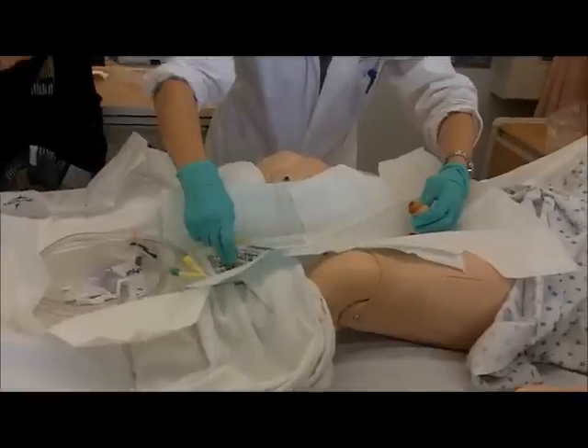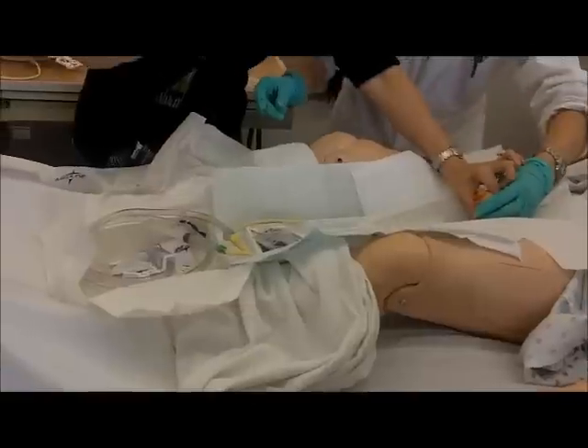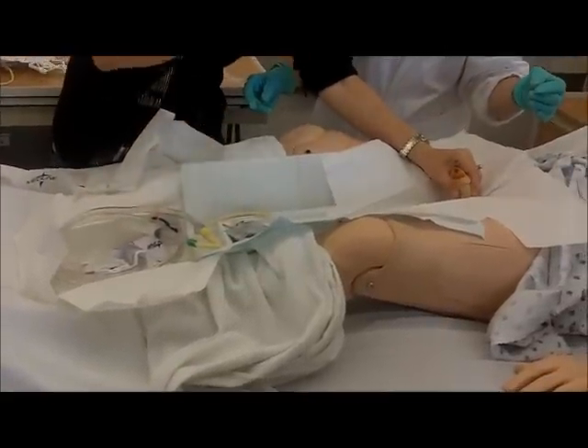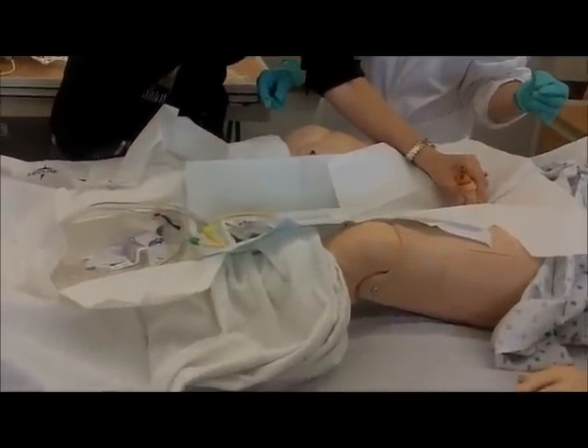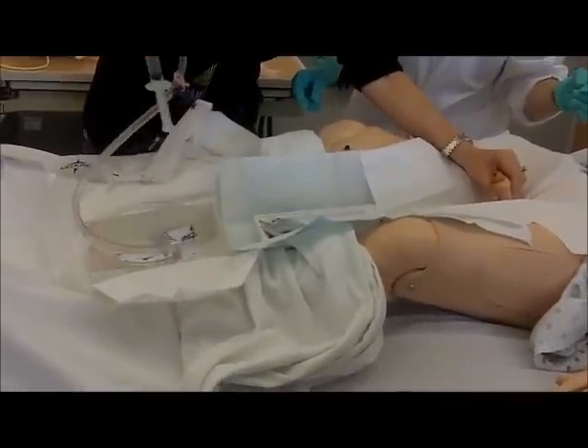You don't need to do it a third time, that's okay. So what I want to show you — what I normally do now — I'm here, I'm holding. And now I need to put this in, but I don't want to let go of this because if I let go of this, it's going to become contaminated. So normally what I do is I grab it like twice — this is sterile.